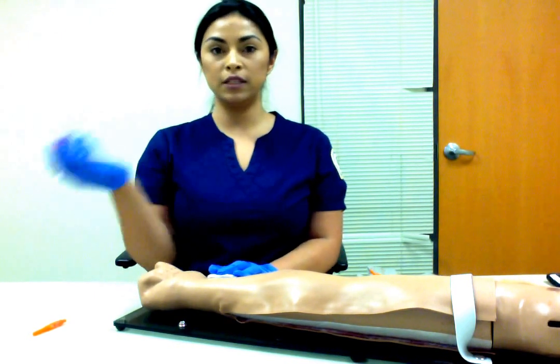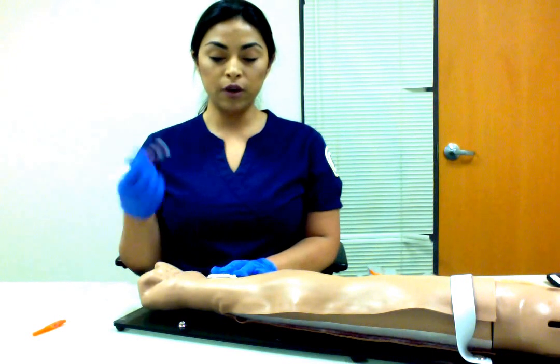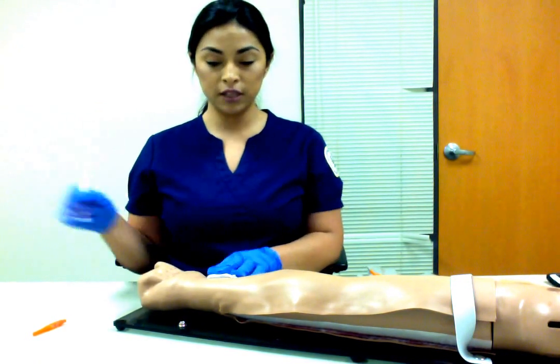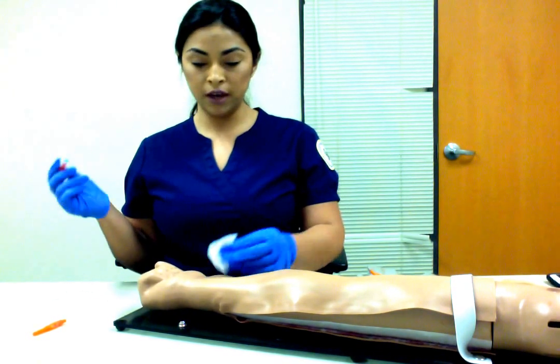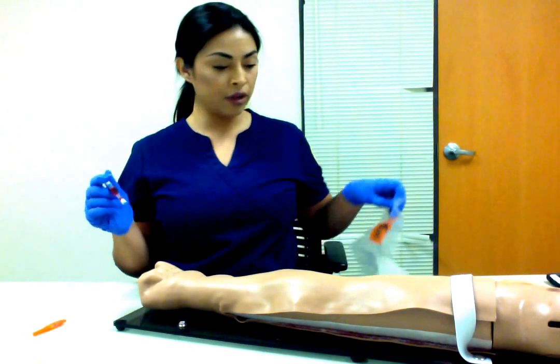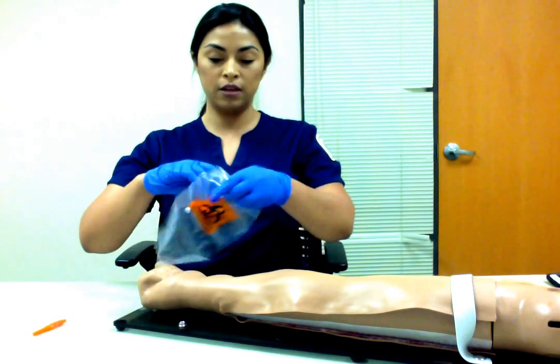And this is to mix the heparin with the blood together. You would want to put pressure on the site for at least 5 minutes or until the bleeding has stopped. At this point, you may toss the gauze and place your sample along with the requisition slip into the biohazard bag.